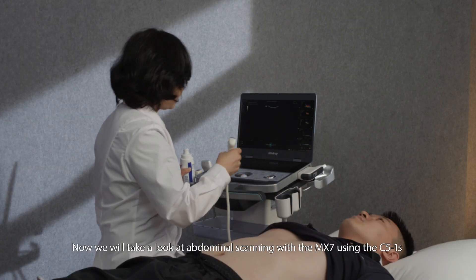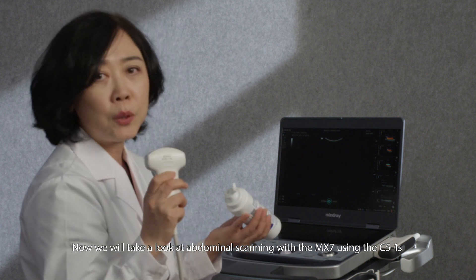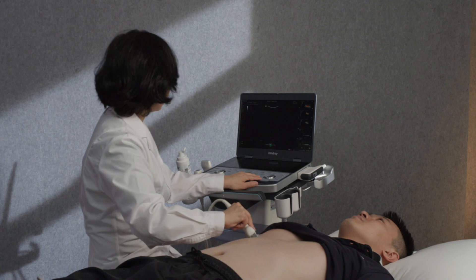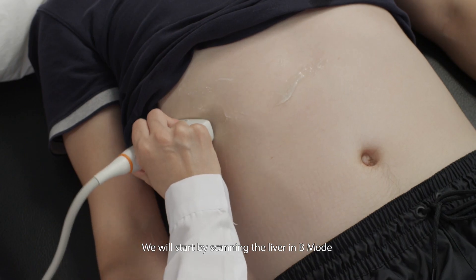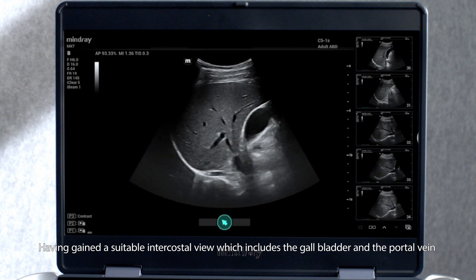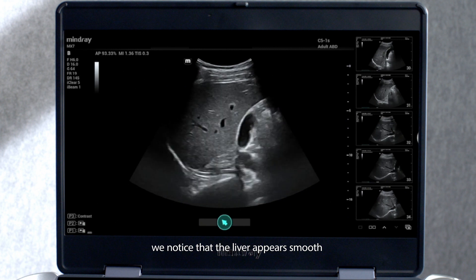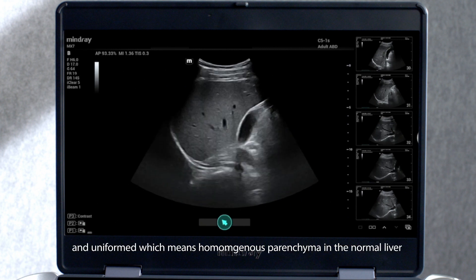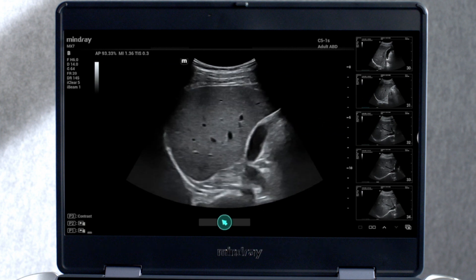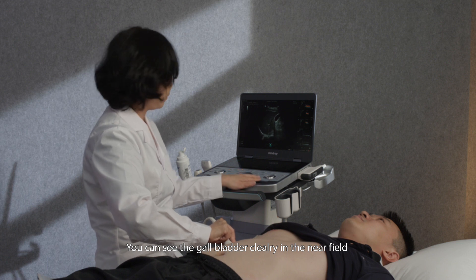Now we will take a look at abdominal scanning with the MX-7 using the C51S. We will start by scanning the liver in B mode. Having gained a suitable intercostal view which includes the gallbladder and the portal vein, we notice that the liver appears smooth and uniform, indicating homogenous parenchyma in the normal liver. You can see the gallbladder clearly in the near field.